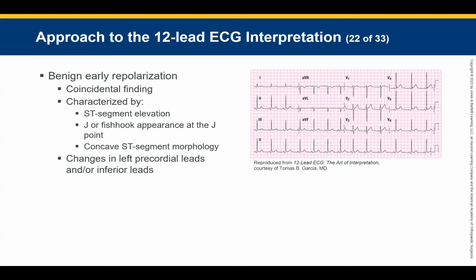Will you put that in a report? That's a good question. No, I'd be like, nah. Not radiology, your actual report. Let me clarify. When I would put it in my actual report is when I'm trying to justify. If I thought QI or somebody was going to look at it and say that was a STEMI you missed, I would make sure to put in that the patient appeared to have some benign early repol, and it does not appear to be a STEMI. In other words, I'm defending why I didn't activate a STEMI.